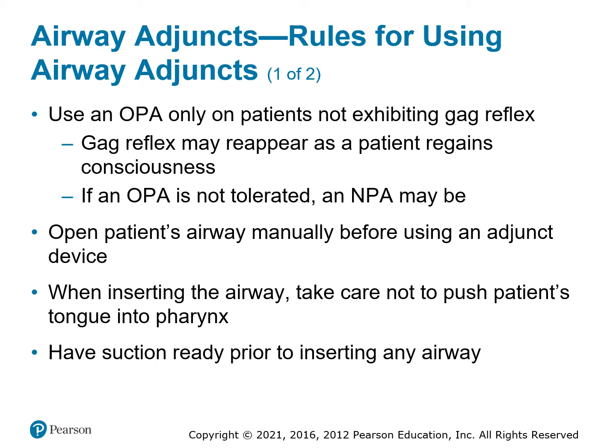Since the OPA goes into the mouth, we do not want them throwing up. And anytime you put your finger or something in your mouth like that, they could gag. And so if the OPA is not tolerated, we'll have to use an NPA instead.